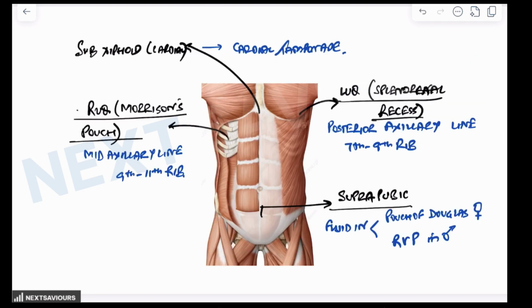Next, questions are basically asked on where exactly the probes are required to be placed in case of EFAST. In EFAST there are six key probe placements for the evaluation of the peritoneal, pericardial, and pleural spaces for free fluid or air.